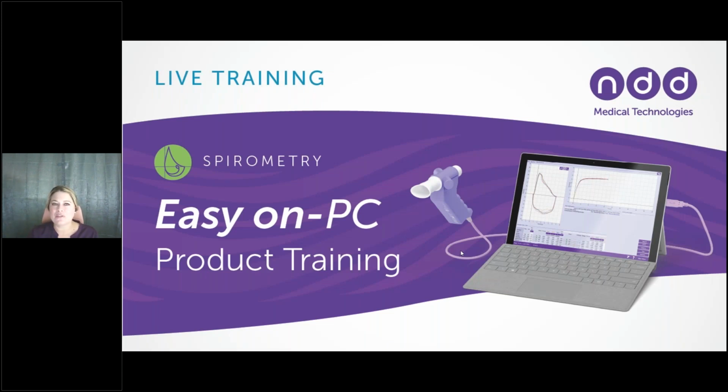This month, we are going through the FVC test on the Easy on PC spirometer. So we are so excited that you have joined us, and we're going to go ahead and get started.